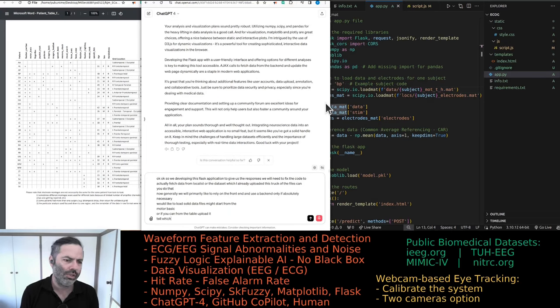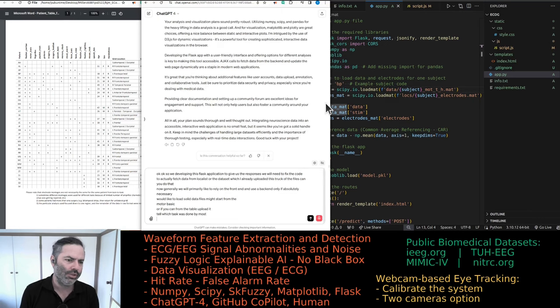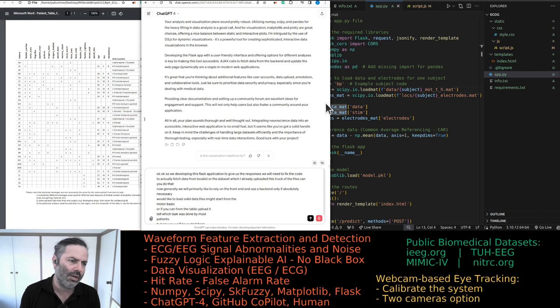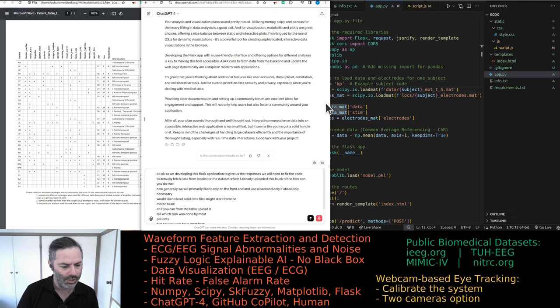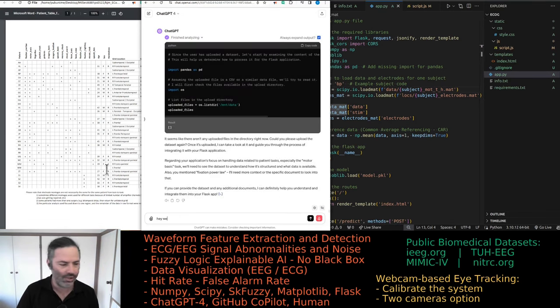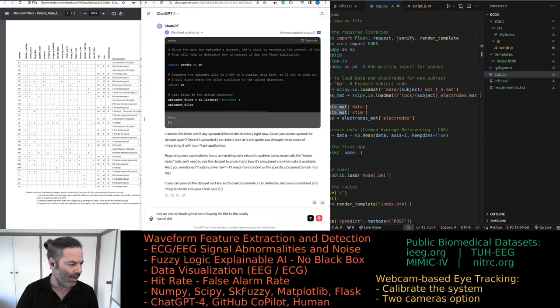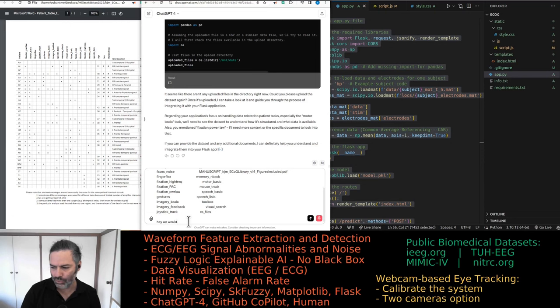We might start from the motor basic task, or if you can, from the table — upload it and tell which task was done by most patients. We'll start from fixation power law, which I don't know what it is. Can you look up in the document and explain what the different tasks are, primarily focusing on the motor basic, considering that seemed to be the one done by most patients? We are not uploading the dataset — it's stored locally.